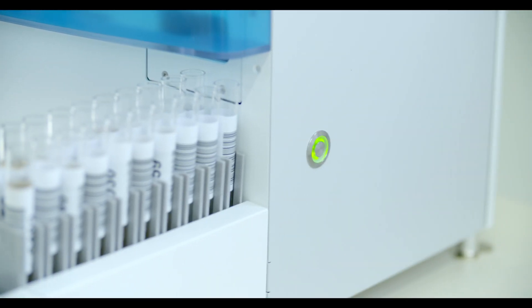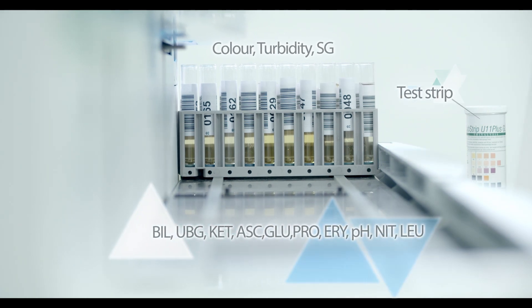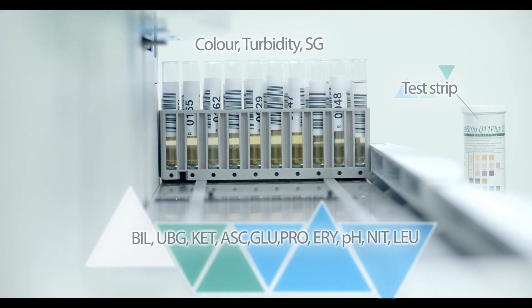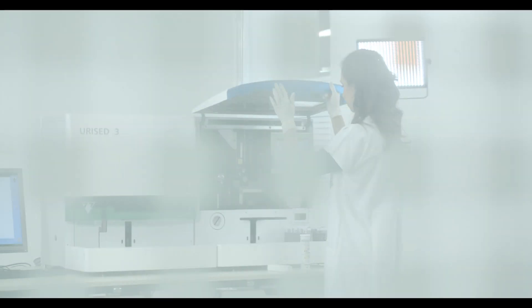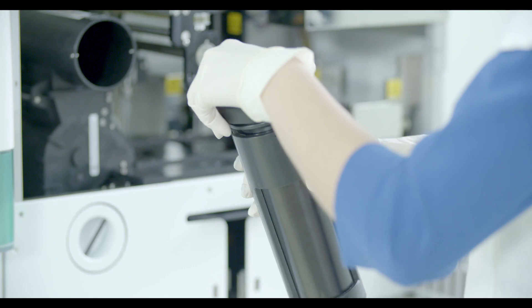Labumat2 is an automated urine chemistry analyzer which evaluates 10 chemical parameters of lab strip U11 plus GL test strip, and three physical parameters are measured by the separate physical measurement cell module.